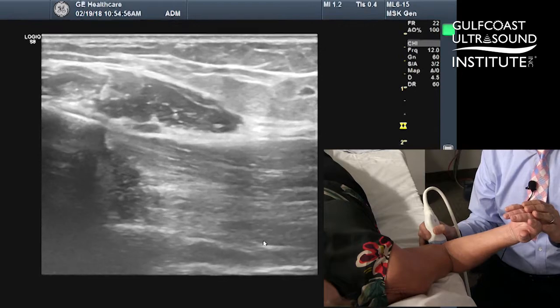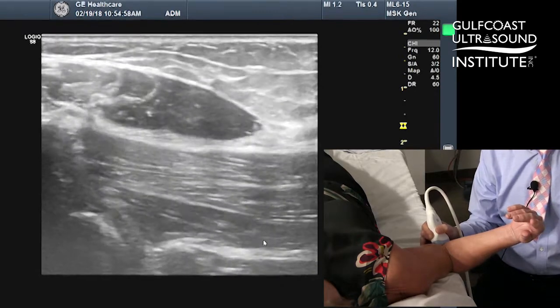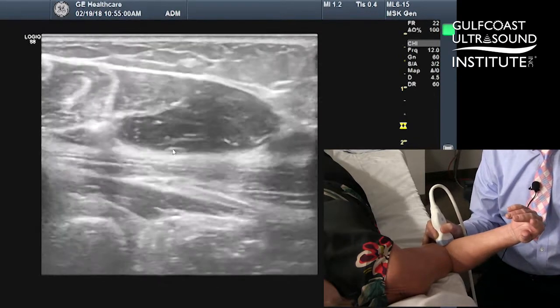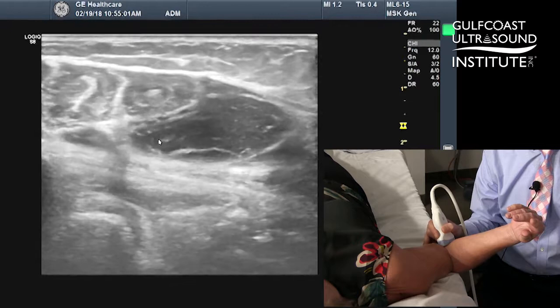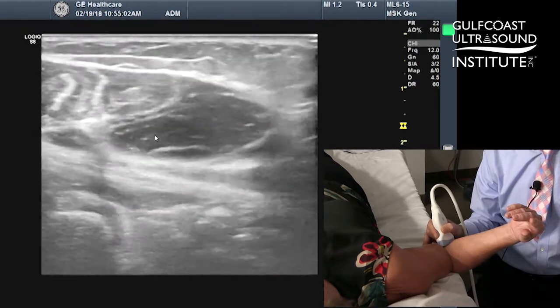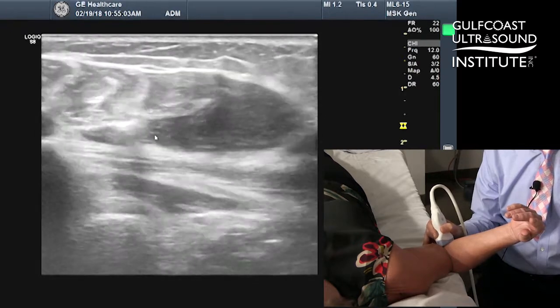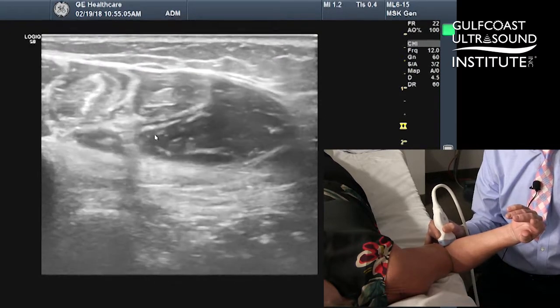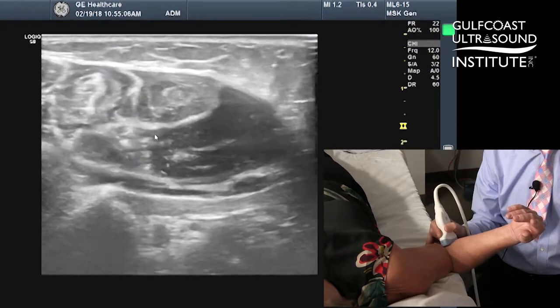Here you're going to slide a little bit anteriorly, and as you look at the screen you're going to start to see a cross-sectional view of the pronator teres, giving this the reason why this is called the pronator window.